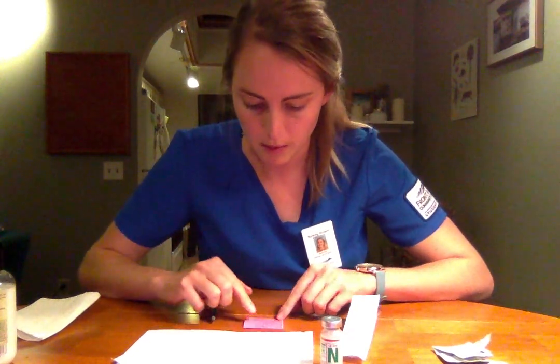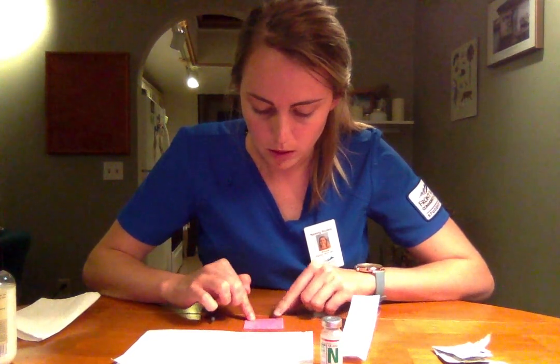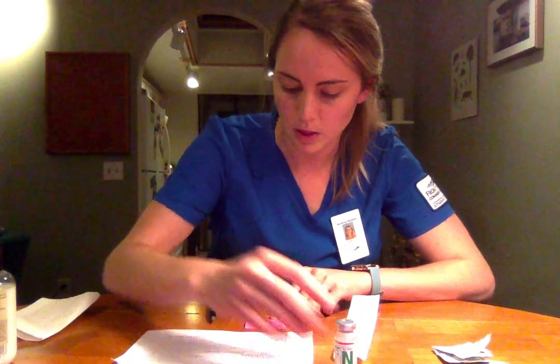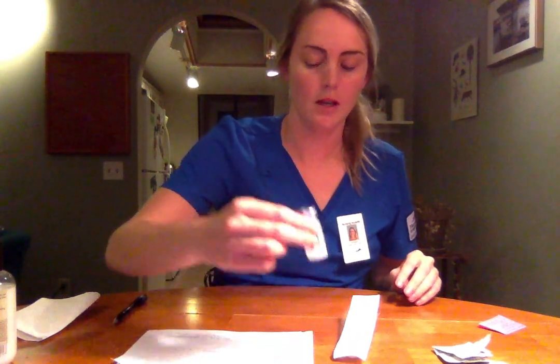Alright, patient name, Abby Abdomen. NPH insulin, 26 units. The date today, time 2100. Expiration date 05/2027. Subcutaneously, and my initials. Okay. Alrighty, so I'll put that on the syringe in a little bit. Now I'm going to get the vial ready.